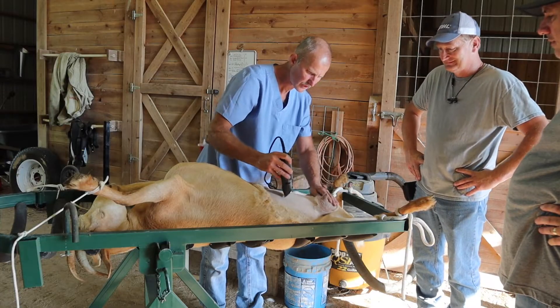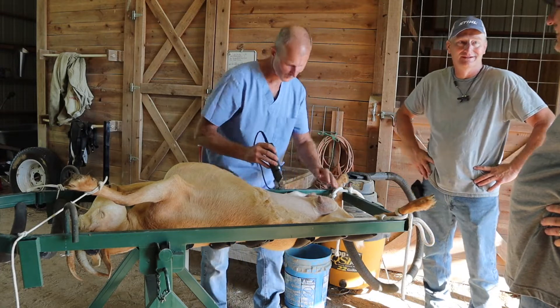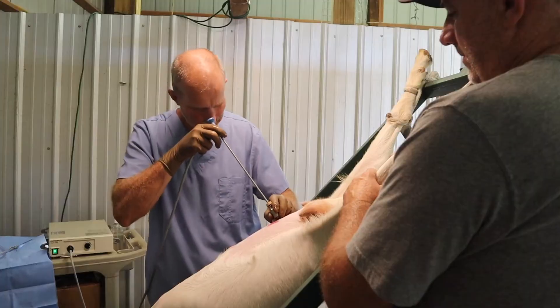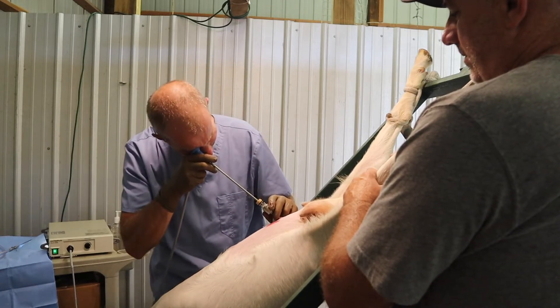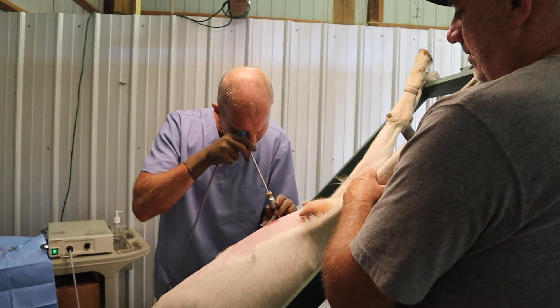We're here today with Dr. Fred Brown. He's a doctor of veterinary medicine and he runs Tall Mountain Kikos, and we're going to do some laparoscopic AI today. We're actually going to be putting some goats to sleep and inserting some semen into the uterine horn. I think you're going to enjoy this video, so hang out with us and let's see how it all works out.